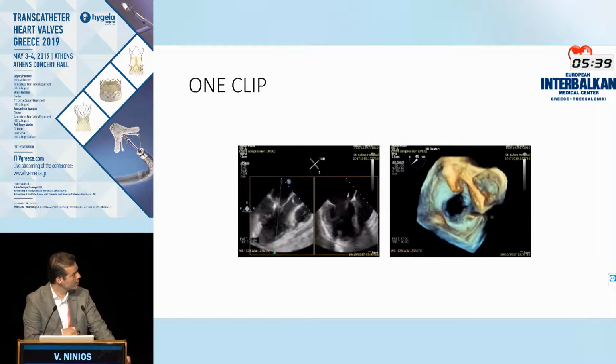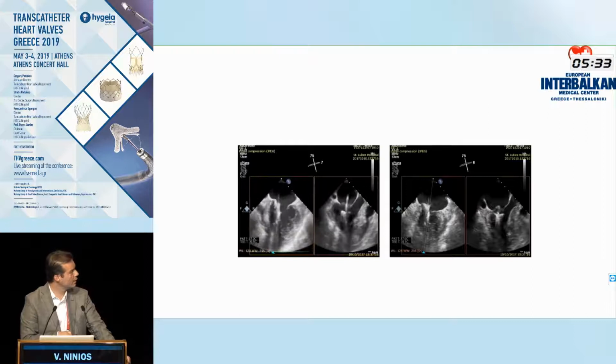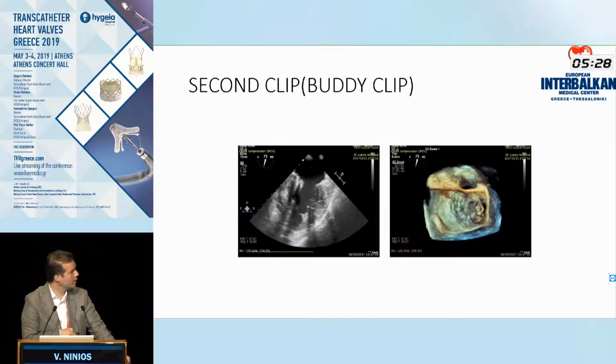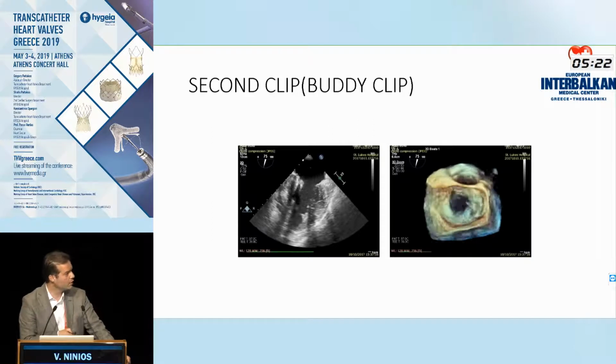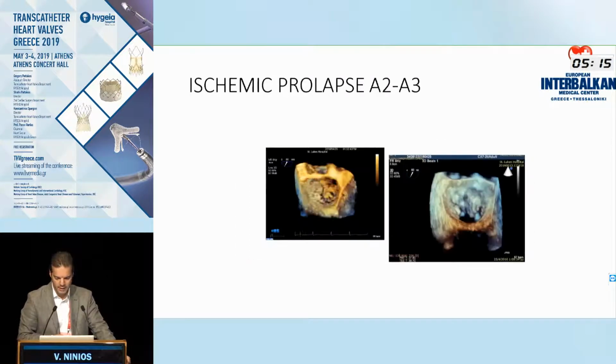You can see this is the septum, this is the clip, and you can see that the clip actually goes on the commissure, and then a second clip follows next to that. And by that, you actually can stitch practically the commissure. So you create a unicommissural valve. You only have one commissure left to open. And you can see some remnants of the cords there from the medial part of the valve.